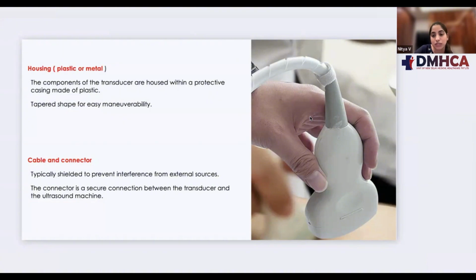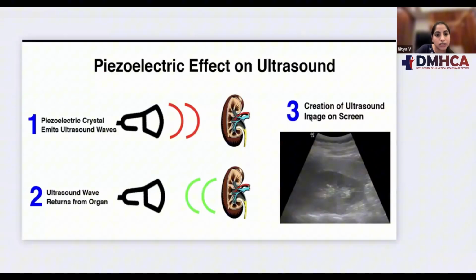So the transmitter is activated, which activates the transducer. There is a secure connection between the transducer and the ultrasound machine, which is provided by the cable. Coming to the piezoelectric effect, it is all based on piezoelectric crystals. In simple language, the piezoelectric effect is the vibration of the piezoelectric crystals.